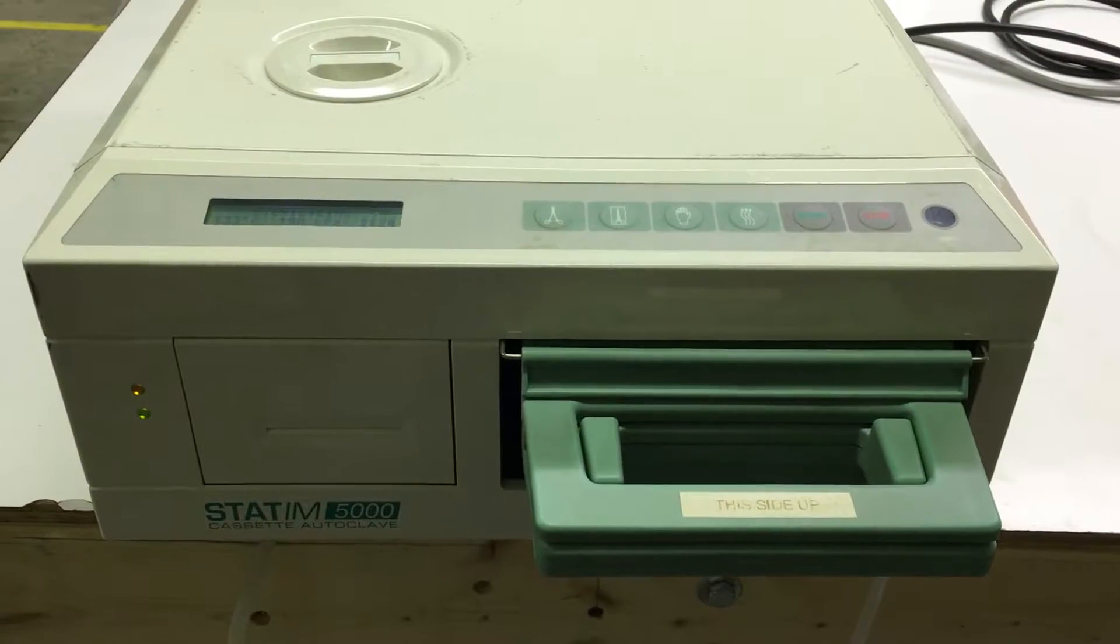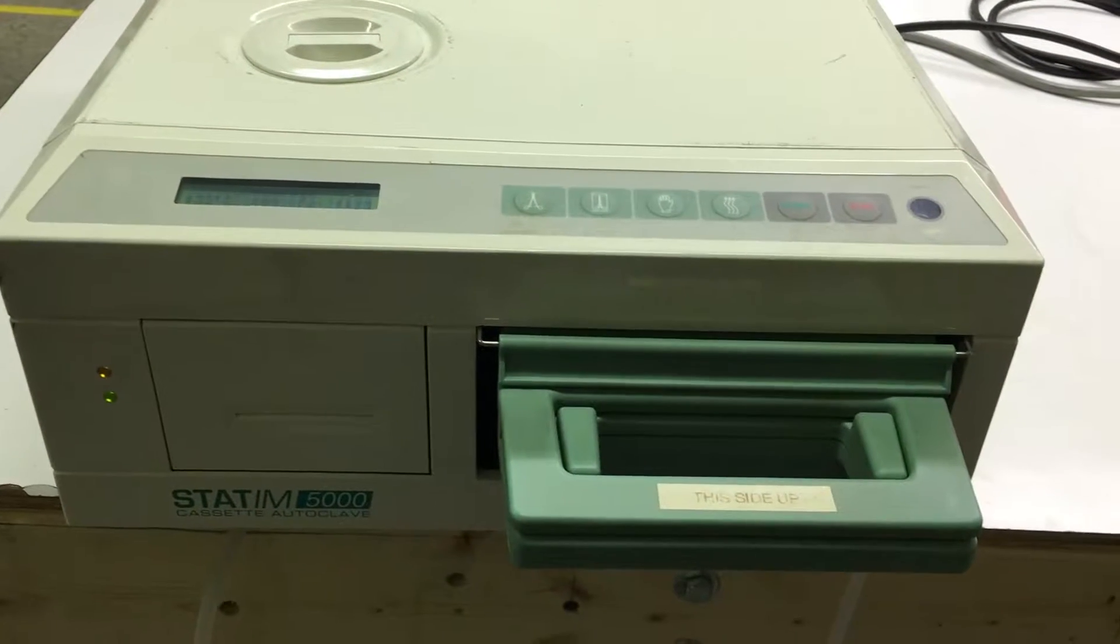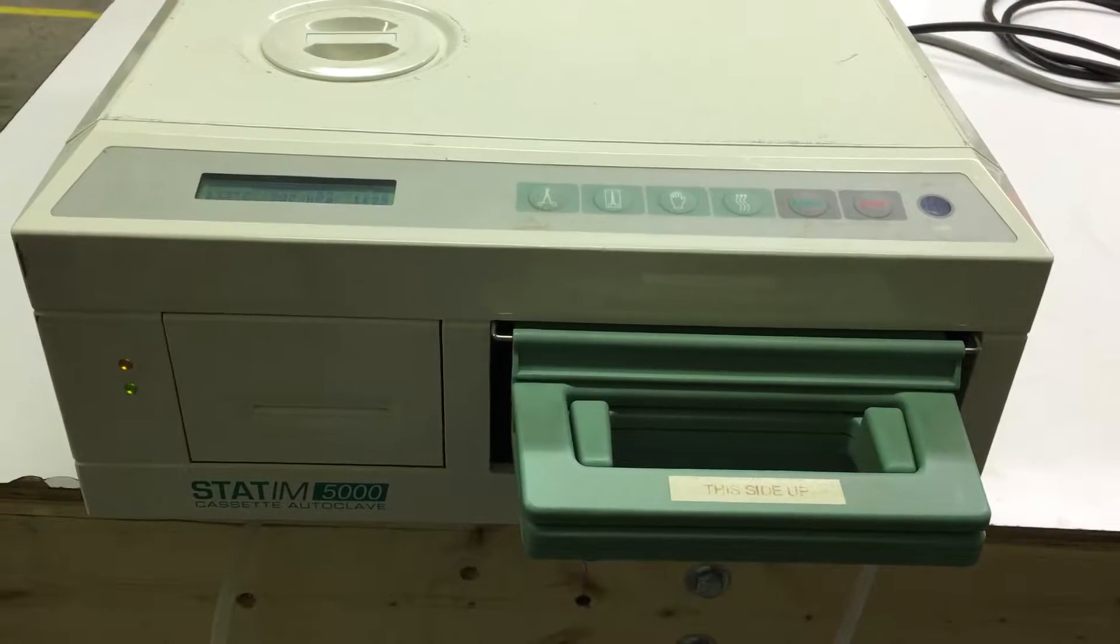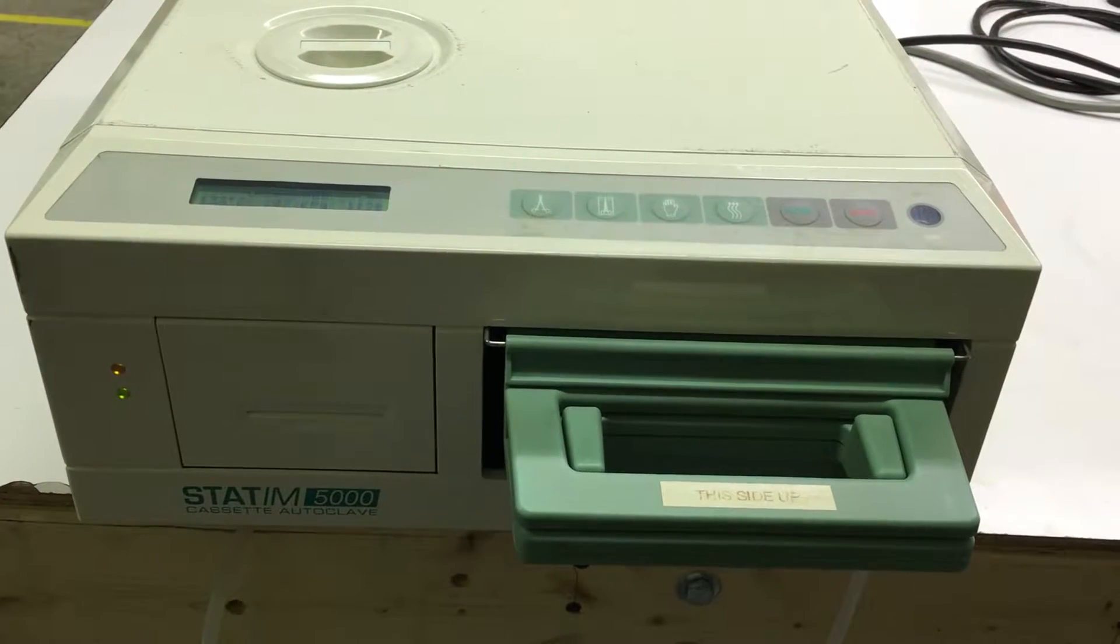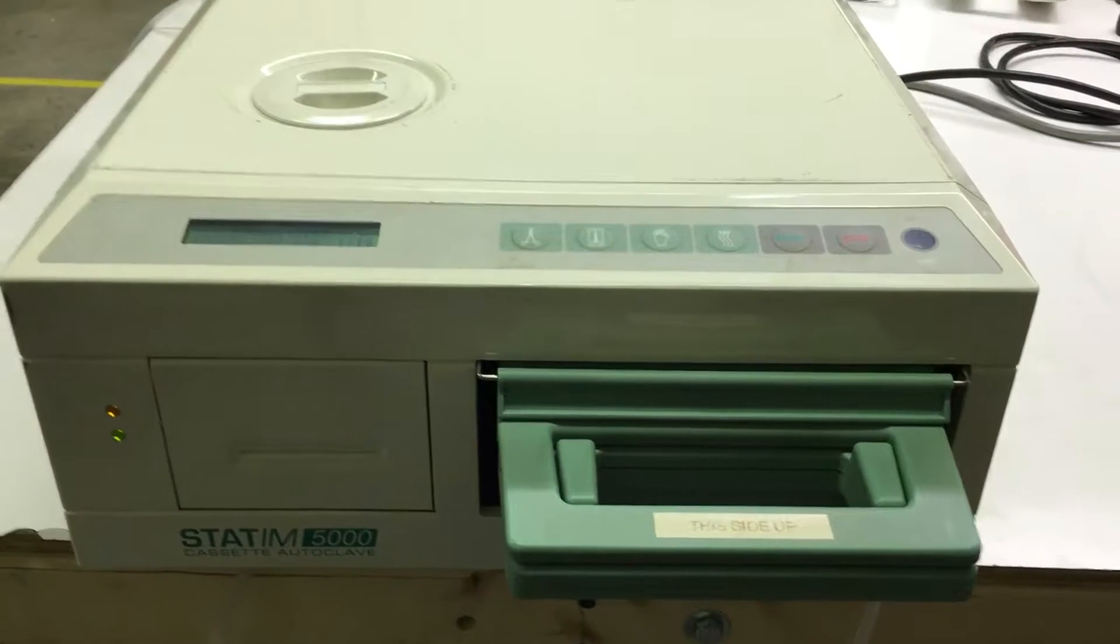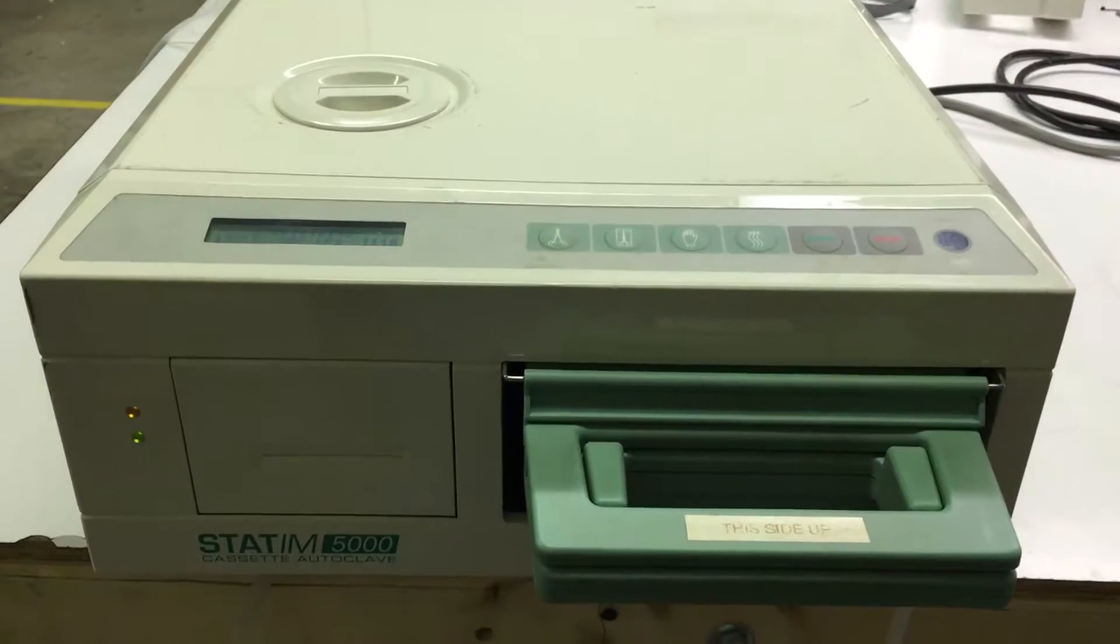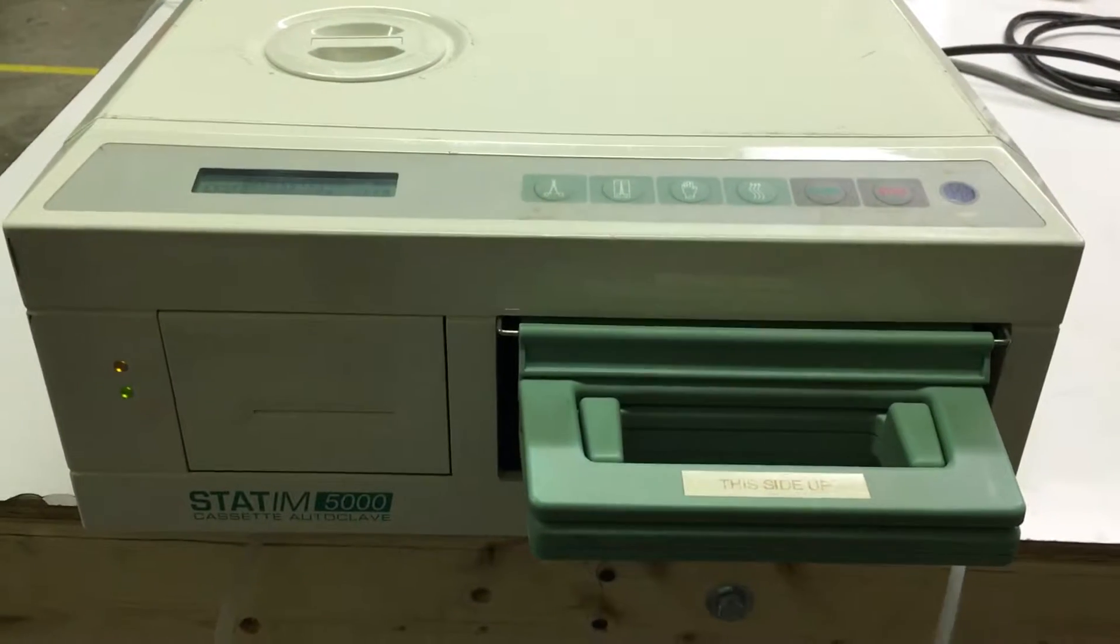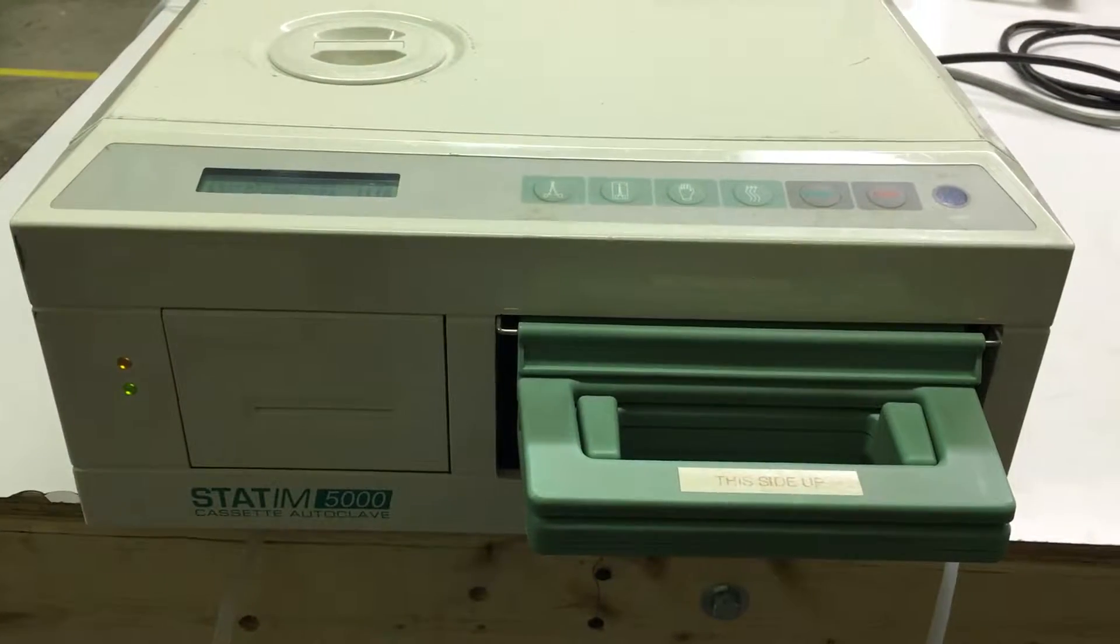Here we go, Sterilizer Autoclave Solutions, Charlotte, North Carolina, doing a Statim 5000 repair for a customer with intermittent cycle fault errors.